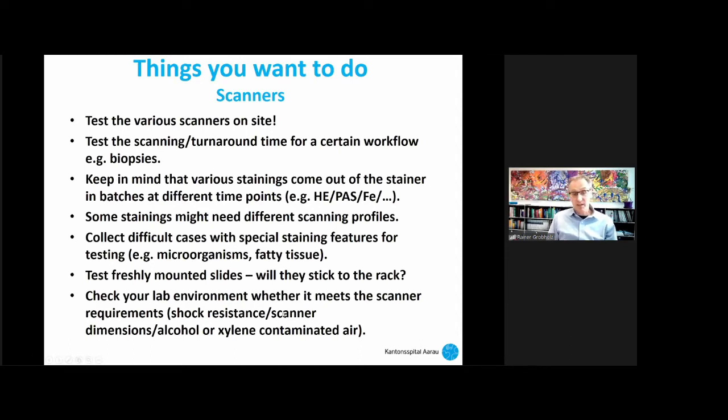And check the lab environment. The scanners are very big. How many scanners do you need? Is there space enough? What about the shock resistance? And check whether or not you have your air contaminated with alcohol or xylene. If so, that might affect your scanner, especially in the sensitive parts like any rubbers or any very significant micro parts of the scanner.